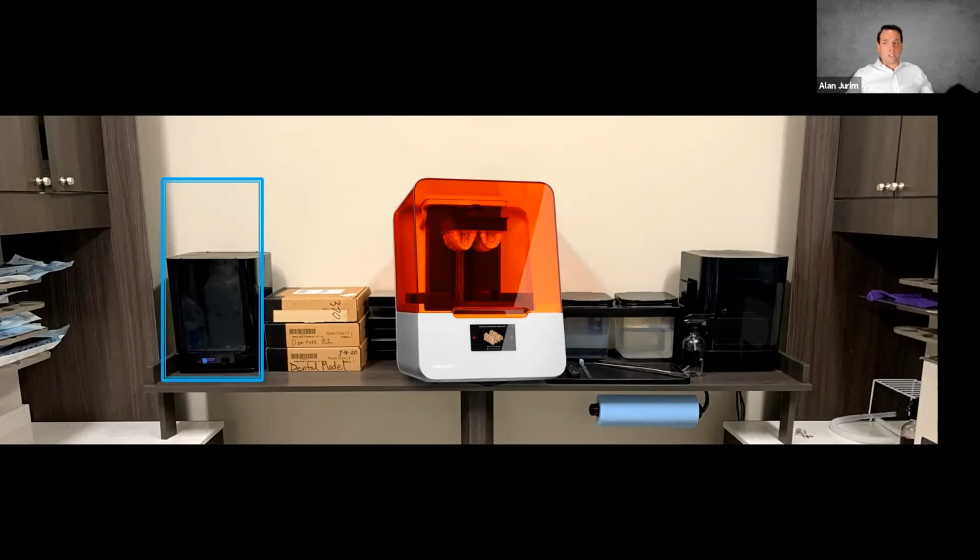It's important to know that you're always going to be post-processing the materials. It's important to know that the workflow is pretty systematic. It's very, very regular to do with different materials in the same process: clean, and then cure. Cure settings change for the different materials.